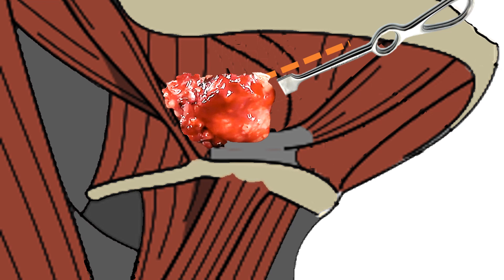Coursing medial to the gland and crossing the mylohyoid are the mylohyoid artery and the nerve to mylohyoid, which supplies both the mylohyoid muscle as well as the anterior belly of the digastric. By reflecting the submandibular salivary gland inferiorly and retracting the posterior border of the mylohyoid muscle anteriorly with a Langenbeck retractor, the fascia covering over the hyoglossus muscle comes into view. The submandibular salivary duct originates from the gland anterosuperiorly and courses medial to the mylohyoid muscle towards the anterior floor of mouth. The hypoglossal nerve and its accompanying ranine veins are seen deep to the fascial covering over the hyoglossus muscle.